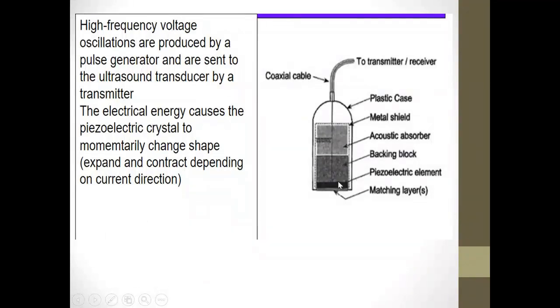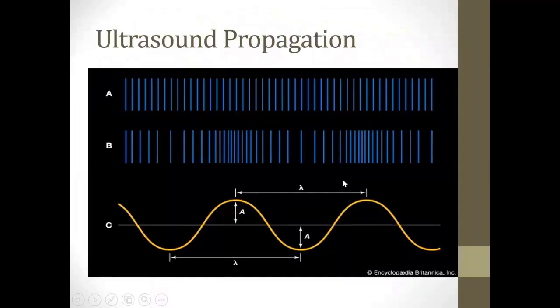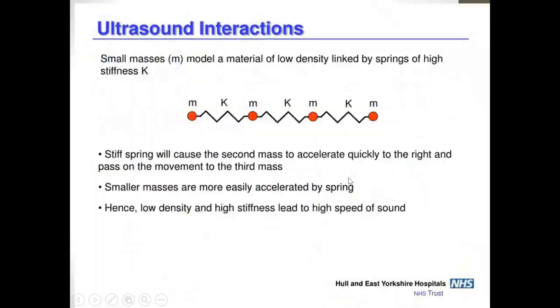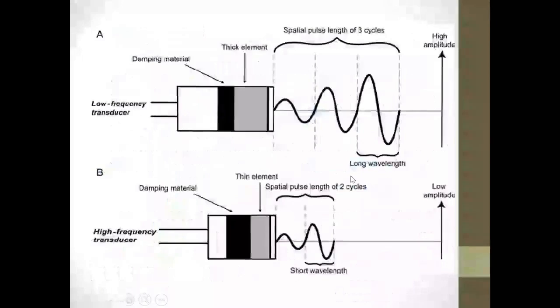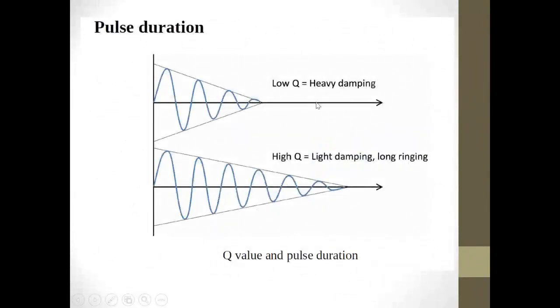We also discussed the backing block or damping material located on the backside of the piezoelectric material and its role in the damping process, which helps to control your pulse. We said that we can adjust it depending on what will happen, as we previously mentioned.